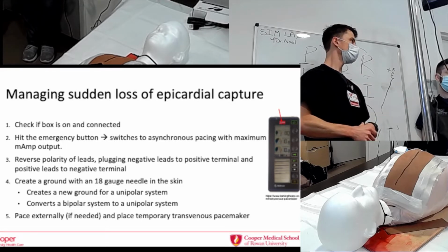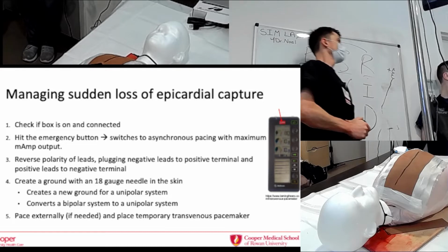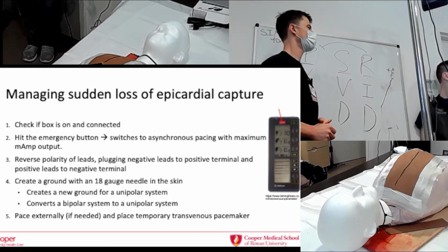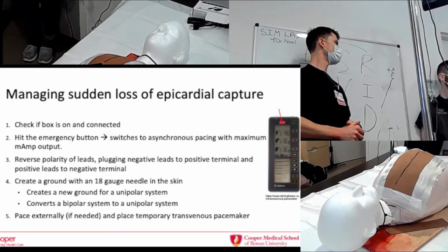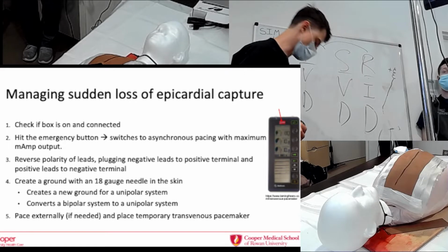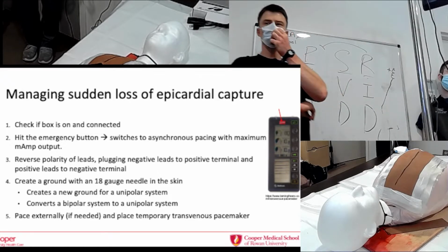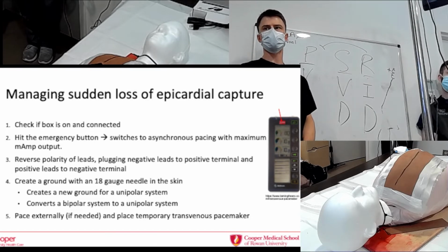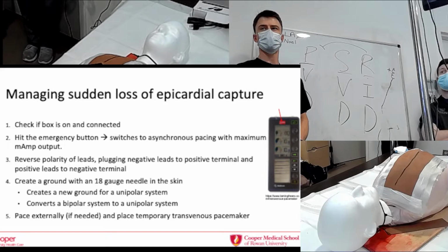Are you getting the pads on as soon as this starts? Oh, yeah. And what's your threshold for transcutaneous pacing? Really minimal. If they're already on, you can try it. It just may not work, with everything that's happening. Especially with a fresh post-op heart, chest tubes in place, and a little bit of air in the mediastinum, you might not get great capture transcutaneously. So the nurses know what to do: you guide them to be your backup support with transcutaneous pacing while you focus on your algorithm.